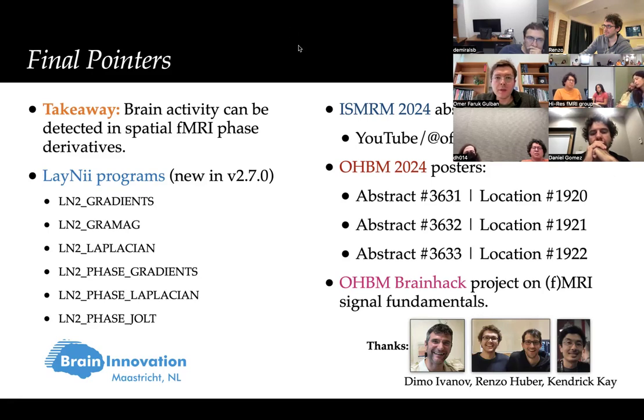Yeah, I mean, that's not what I'm doing. I was just showing the oxygenation-related changes in the long echo time phase Laplacian. So I'm not trying to find their effects in the normal fMRI data. It's clear. I'm just saying that you were saying you didn't see anything in white matter, but that is just because your phase stability is not nearly as good as what they have. Yeah, sure. No, I very much agree.